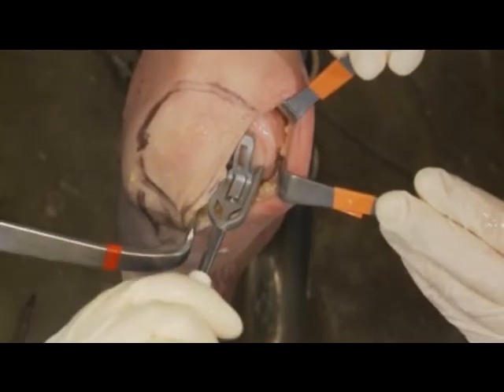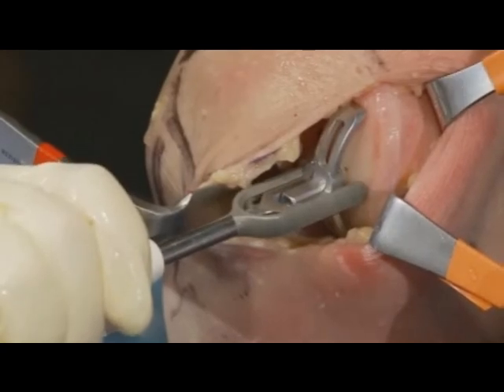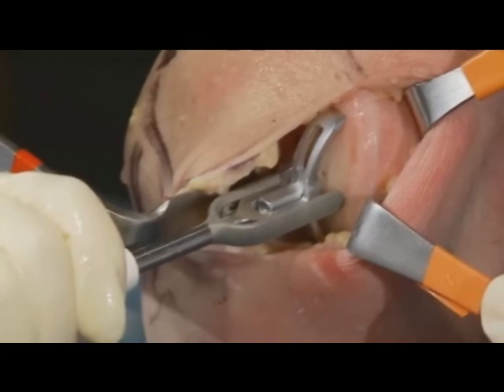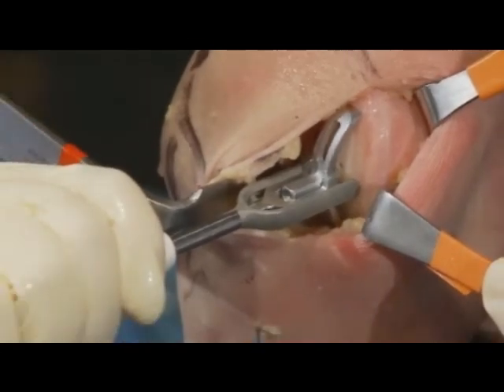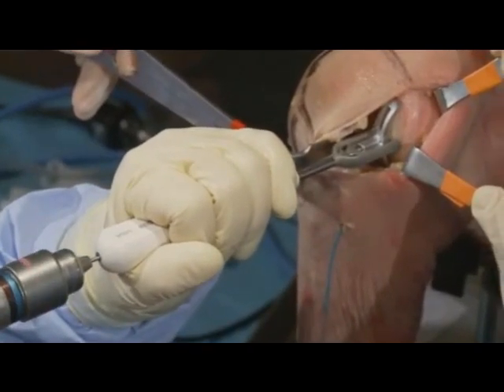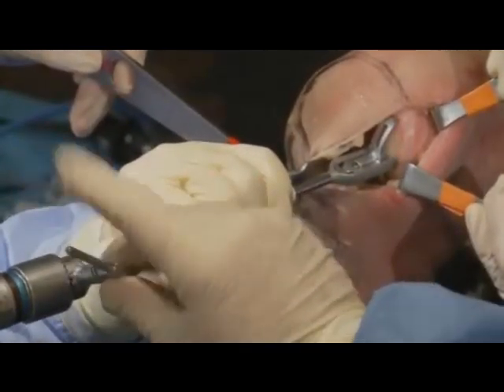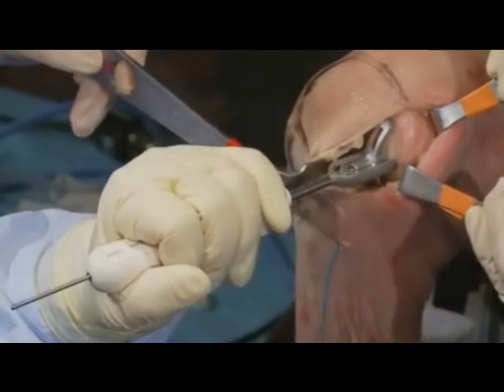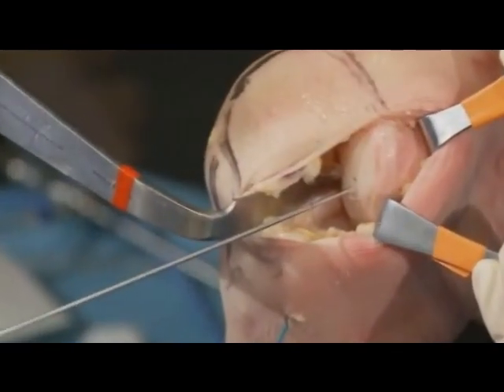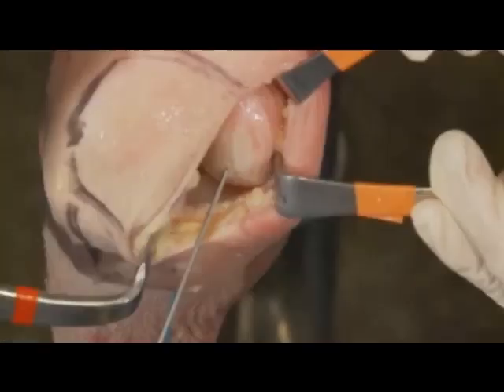So we put it down. We're happy with the position from medial lateral, and you can see it's touching at the top, and I can see that it's touching at the back here, so that we're happy with that implant. So once we're happy in that position, what we do is we put a guide wire and we insert it straight down. And these guide wires are all laser marked and etched, because all the depth cuts are going to be based off of these laser marks as we put them in. So that's our first pin, and that is probably the most important pin in terms of getting things started.